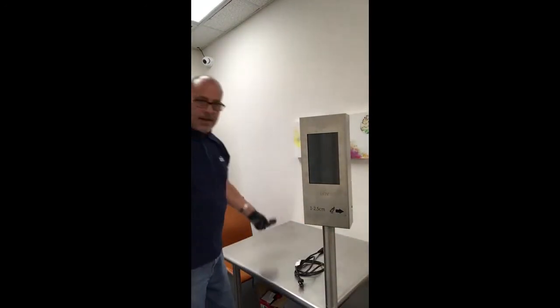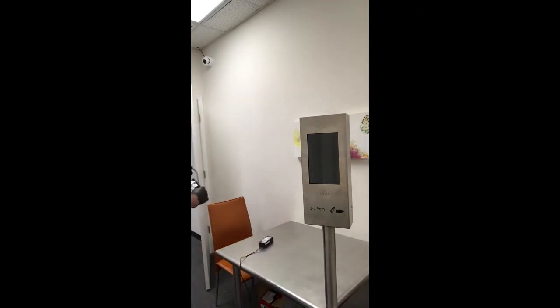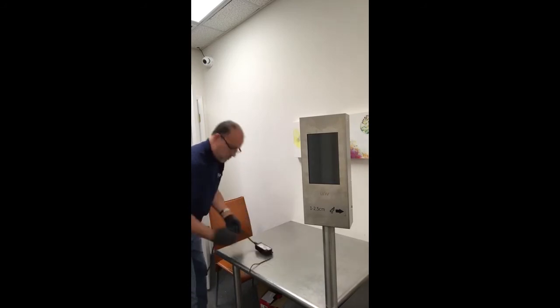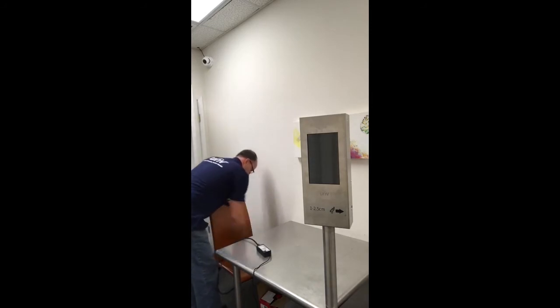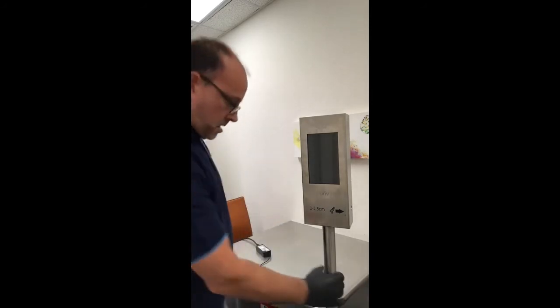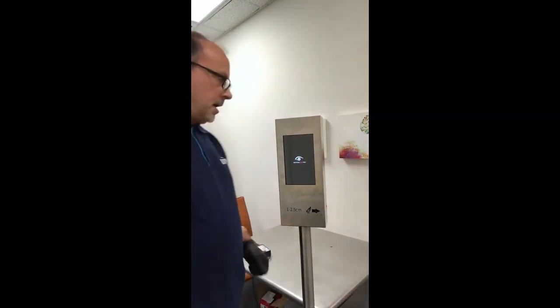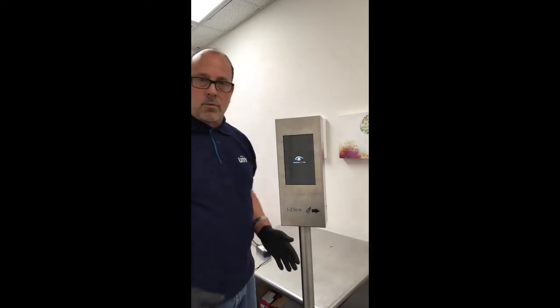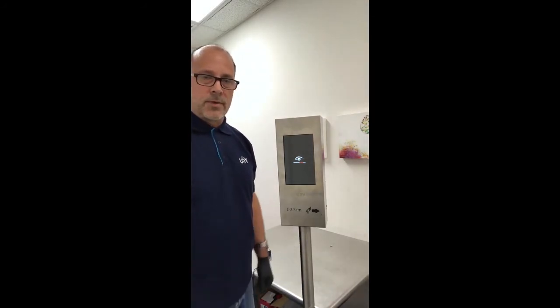Now we're going to plug in our power adapter — it can be plugged into any regular wall outlet. The unit will start to boot up. It takes a few seconds, but essentially we're all installed and ready to go. We're just waiting for the unit to boot up so it can start reading temperatures.